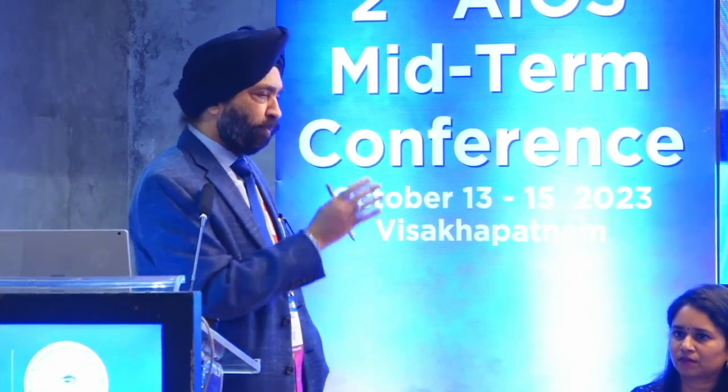So therefore, as I told you, either I go in for my monofocal, I go in for an advanced monofocal, or I go in for a trifocal straight off. I don't have anything in between, because the incidence of dysphotopsias, because of the edge treatment of the steps, whether in the Zeiss or in the Synergy or Panoptix, doesn't come down to that. I think they're coming out with a new lens so that the dysphotopsias have gone down.